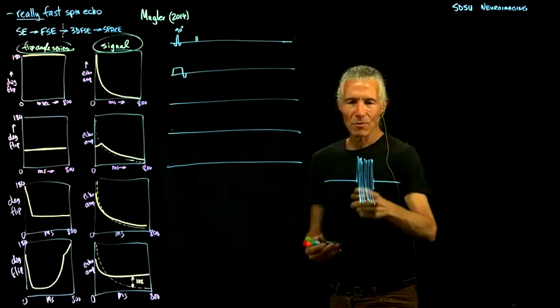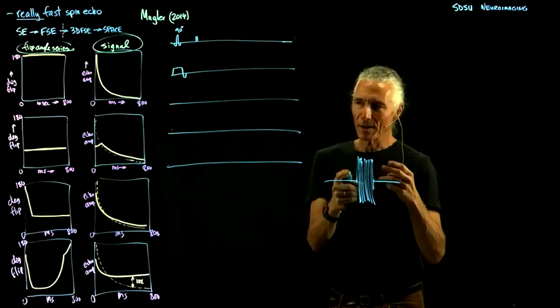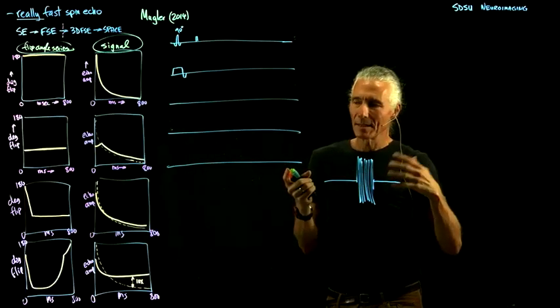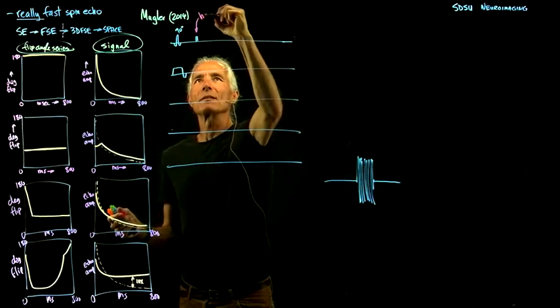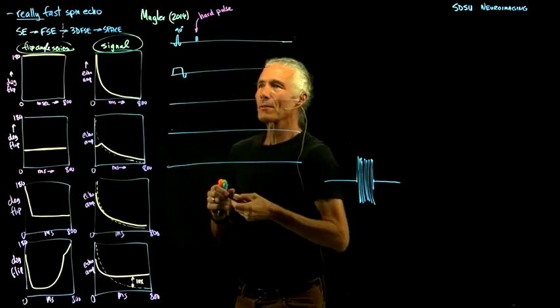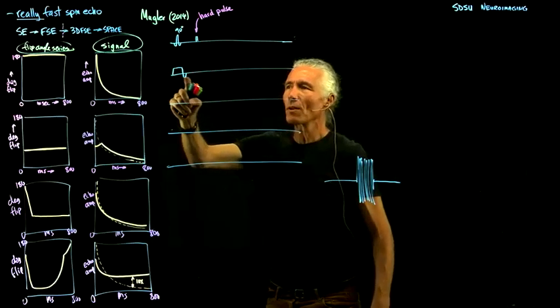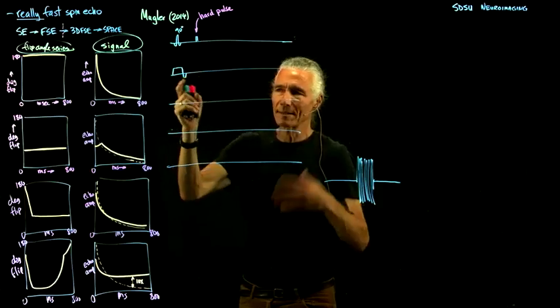And what does that do? If you do this on the transmitter, you Fourier transform that into what that means in frequency, and it means like a sinc, but it's a really wide sinc, and so it's effectively just stimulating the entire range. So this is a hard pulse. That's really quick. And don't bother turning on any slice select gradient, because that would just slow you down. So you've flipped a set of spins, but now once you've flipped those set of spins, just stimulate everything.